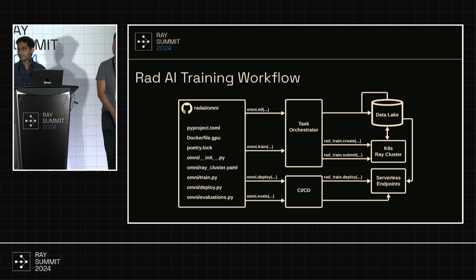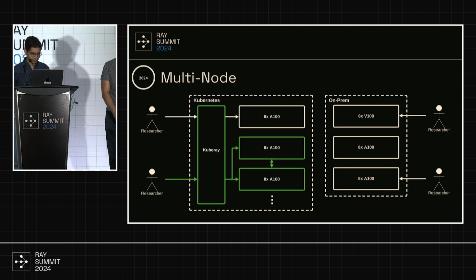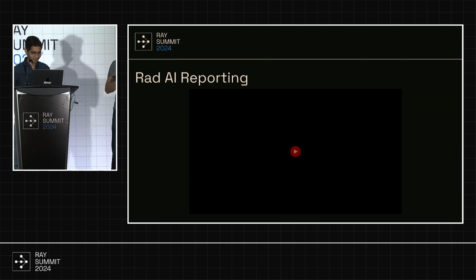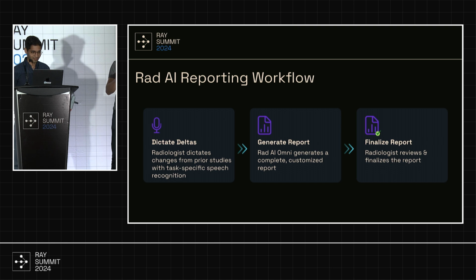I didn't completely understand your training aspect of it. You took the audio and converted it into the radiology reports, right? You're not doing any image training on the radiology specialty, right? That's a really good question. There are two things we're doing. First, we take voice and turn it into text. The second is we take the output text, which is just a few bullet points, and turn it into a full report. So there's voice to text, and then text to text as well. We don't do imaging yet, and that's something we're exploring for the future.